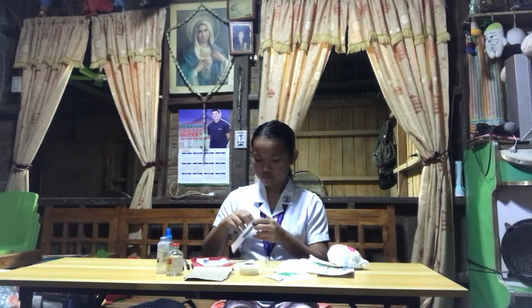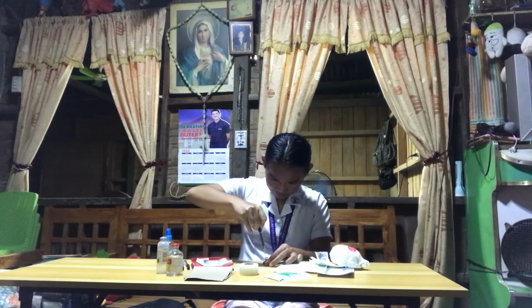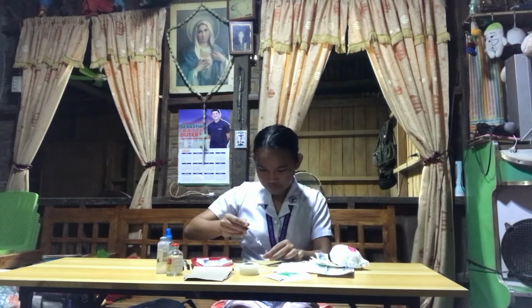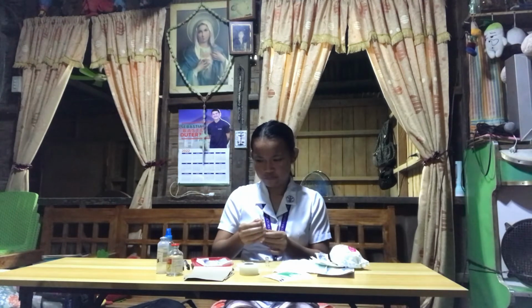Since this is a 1 ml ampule, we're going to use the 1 ml solo shot syringe. Okay, and now we're going to place it on the medicine tray with the corresponding medication card.